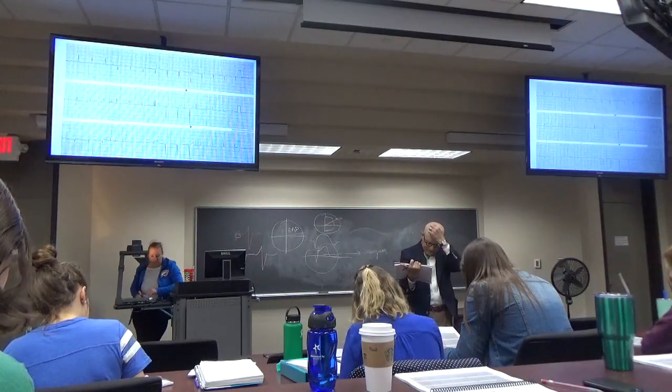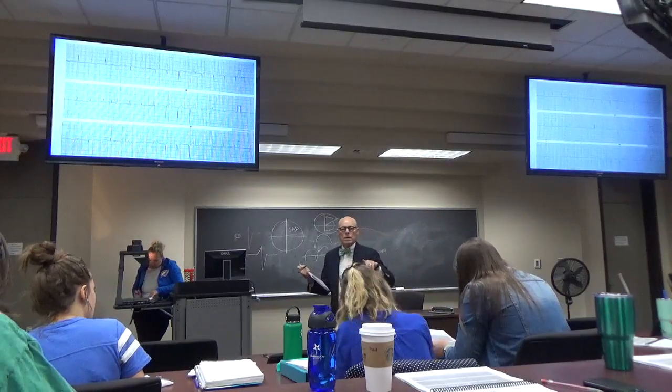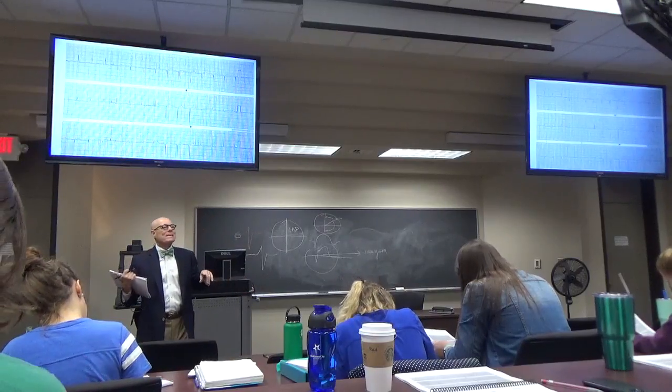I don't think there is one. Okay. I think the PR is less than 0.20. I think it's probably 0.16. Other questions?